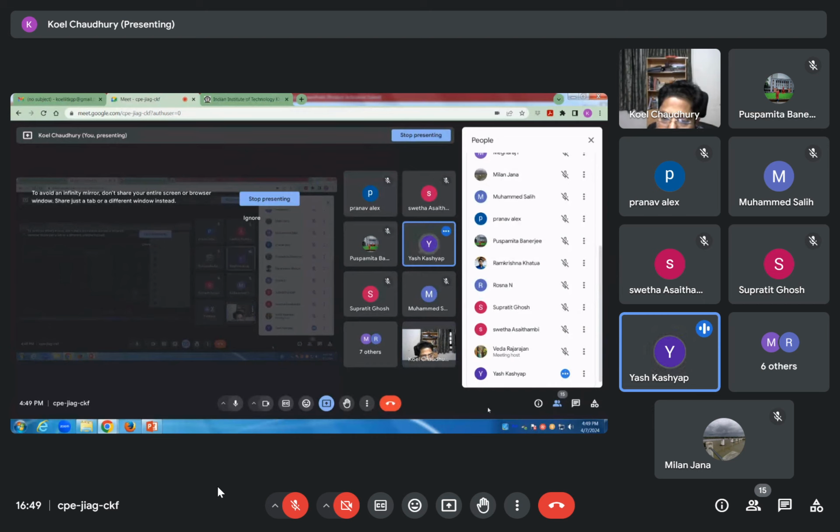Ma'am, right at the beginning, we have a pulse, right? A 90-degree RF pulse. Excellent. Then at half TE, we provide a 180-degree RF pulse. Excellent. And then we will have an echo after some time, in between you have rephasing, dephasing, and then you have the echo, and that point is called TE, time to echo, right?